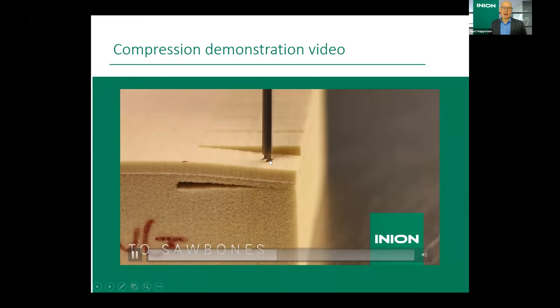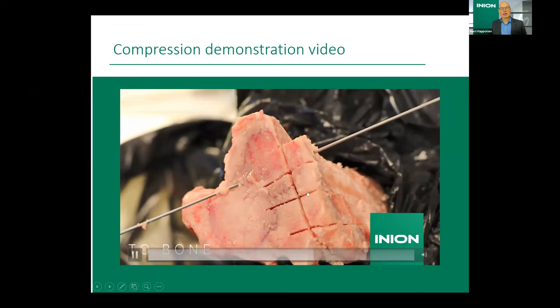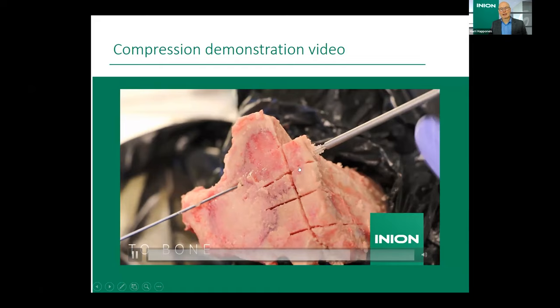We made the same kind of simulation in animal bone, and there is also a hole made already in the bone. And when you insert the screw, you can see that this osteotomy line is nicely compressed together with the screw.